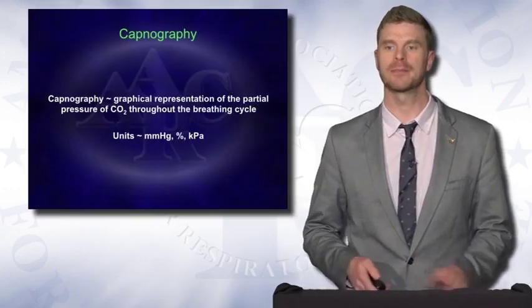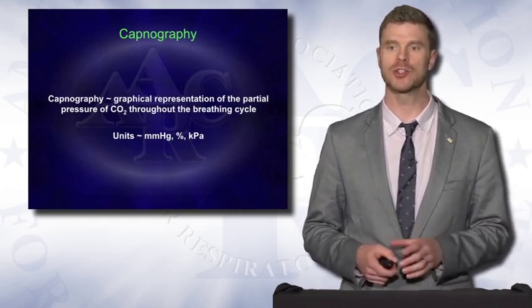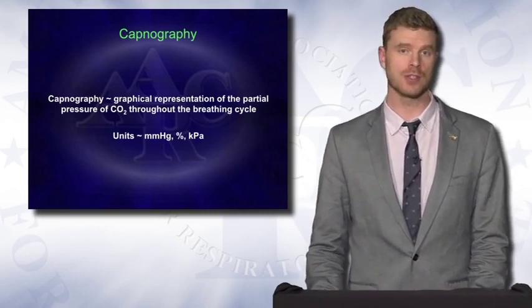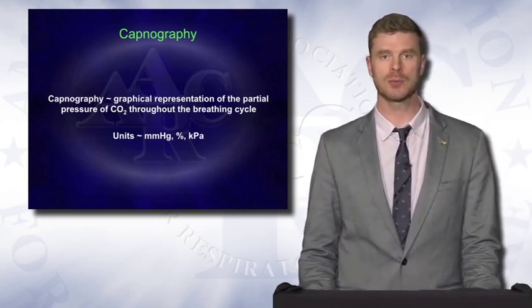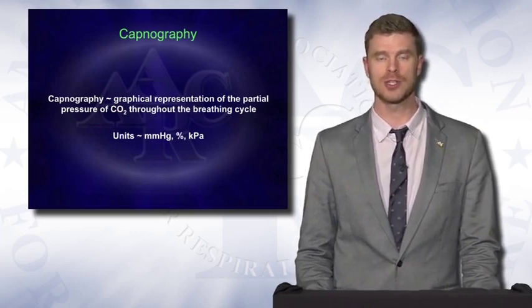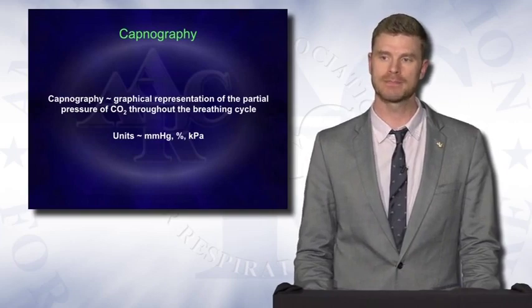So capnography. I think this may go without saying, but it's really the graphical display or presentation of the partial pressure of CO2 throughout the breathing cycle. The units often seen in the North American space of the world is millimeters mercury, but you may sometimes see percentages or even kilopascals or some other measure of pressure.